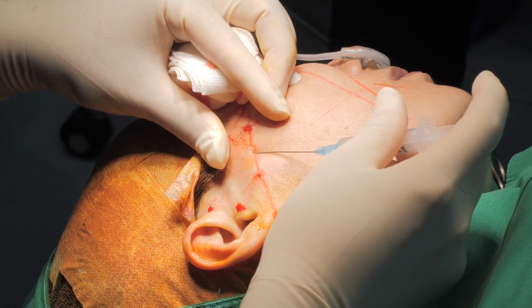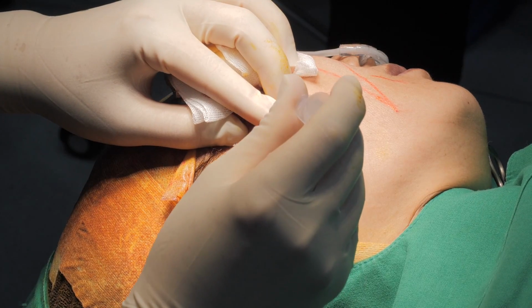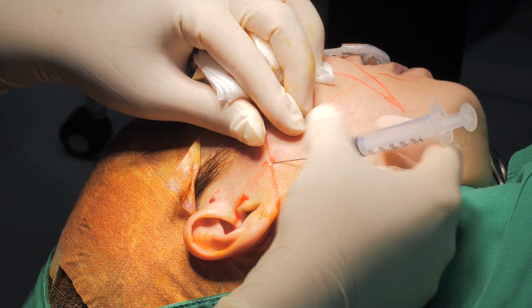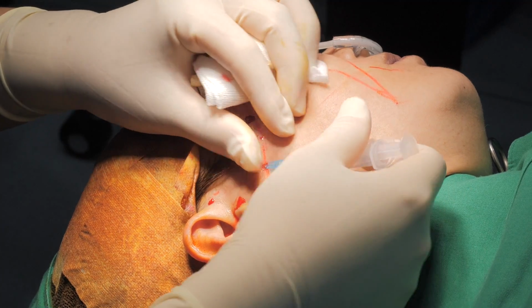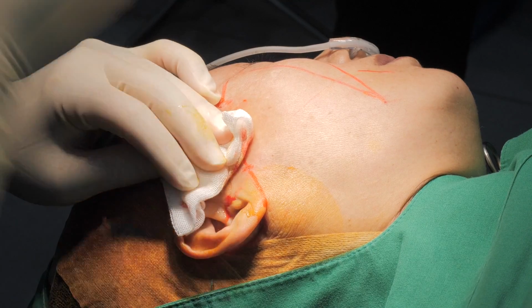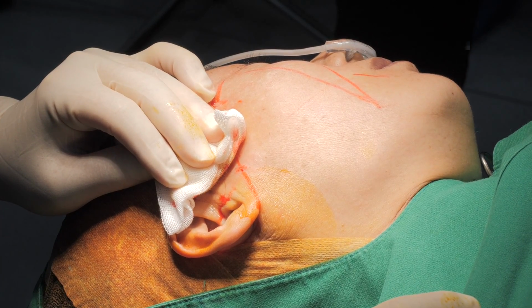Are you doing the numbing superficial? Sorry? The numbing is being superficial? The anesthesia, you're placing it superficially, yes. But you're opening the space that you mentioned in the class, right? So that's what you're doing, opening a little bit of the space for you to go in with the threads.